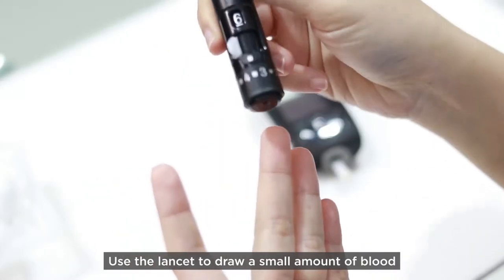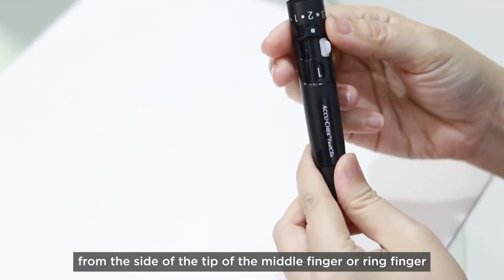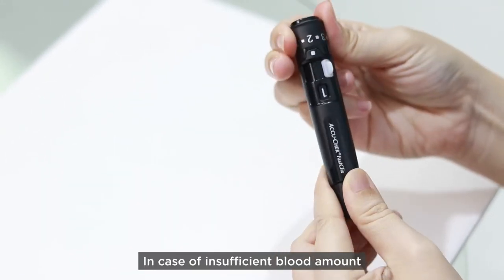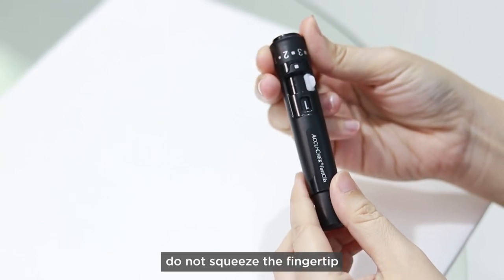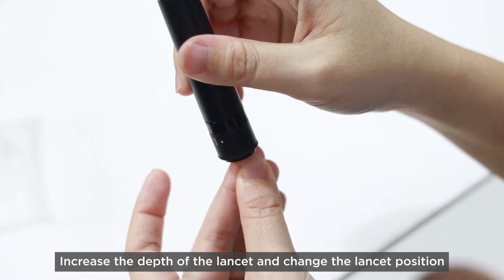Use the lancet to draw a small amount of blood from the side of the tip of the middle finger or ring finger. In case of insufficient blood amount, do not squeeze the fingertip. Increase the depth of the lancet and change the lancet position.